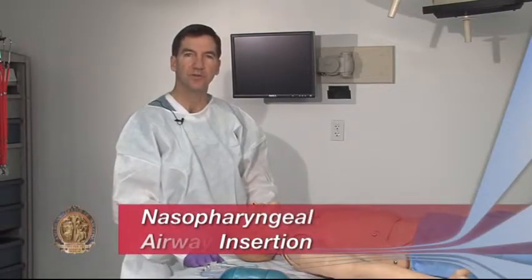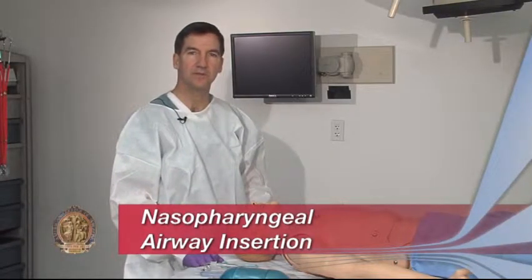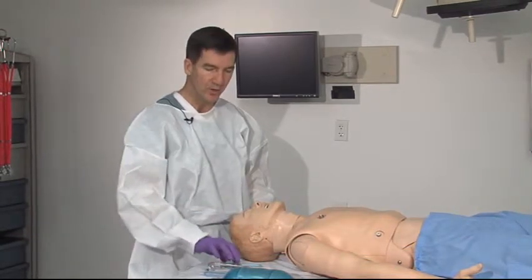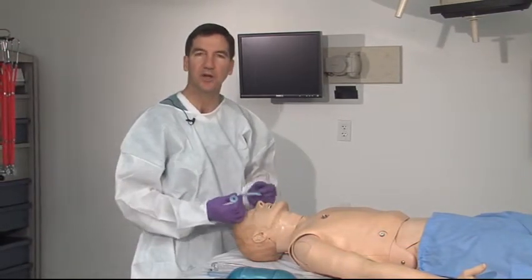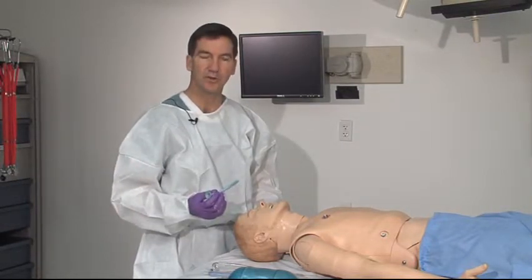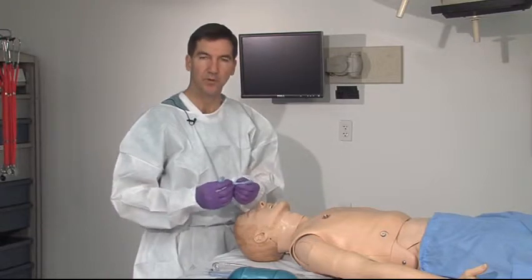The skills required to ensure that the adult airway is maintained are critical for a successful resuscitation. One of the easiest and best tolerated by an awake patient airway tools is the nasopharyngeal airway, a soft rubber device.